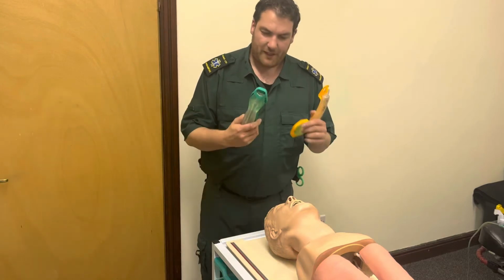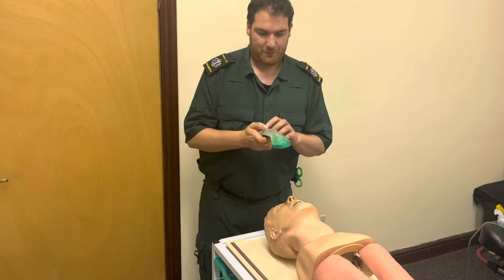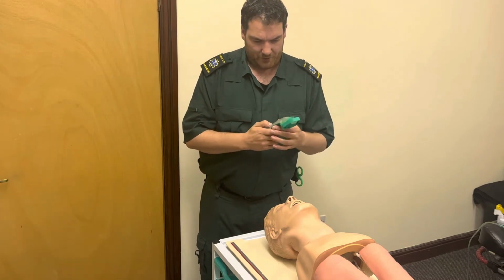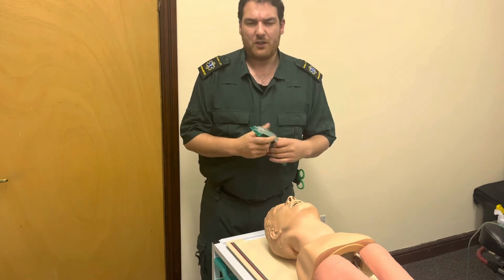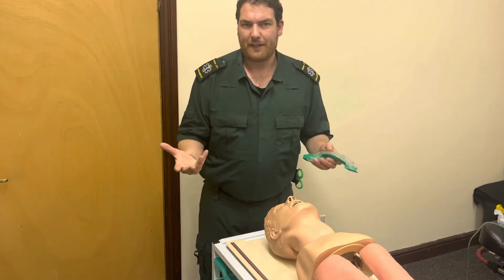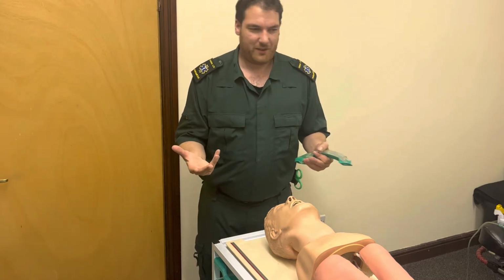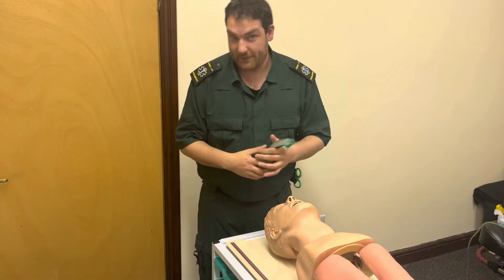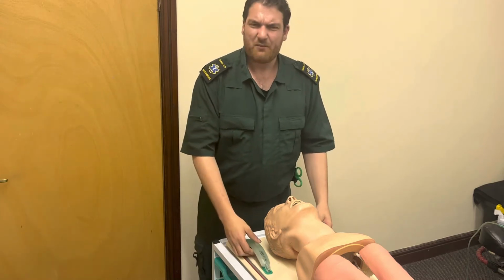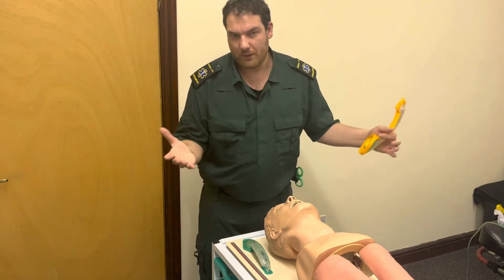Excellent. So here we have the i-gels. These are gold standard in the pre-hospital setting. An i-gel is used based on their weight. Usually we have size 3, 4 and 5 for an adult. Size 3 is usually 30 to 60 kilograms, which is for like frailty. Size 4 is 50 to 90 kilograms, which is the average size. And then size 5 is over 90 kilograms for the bigger people.